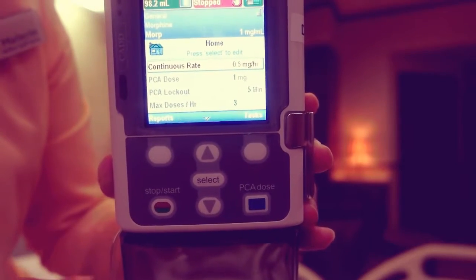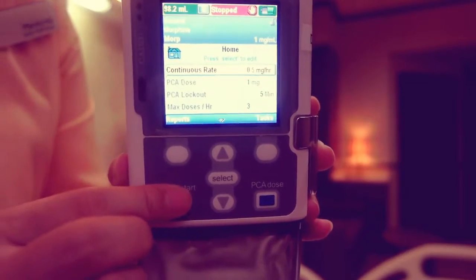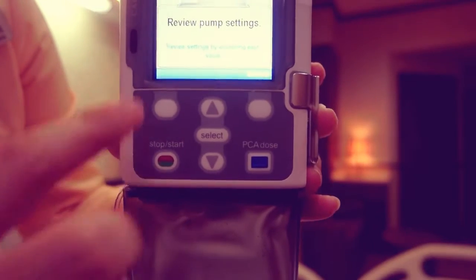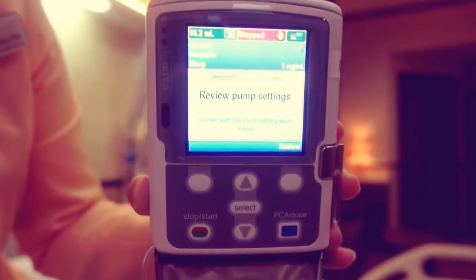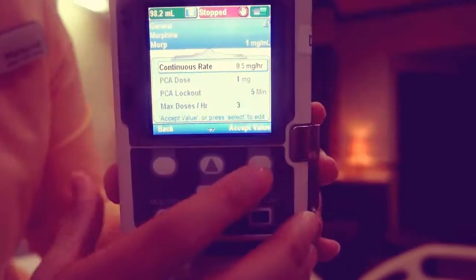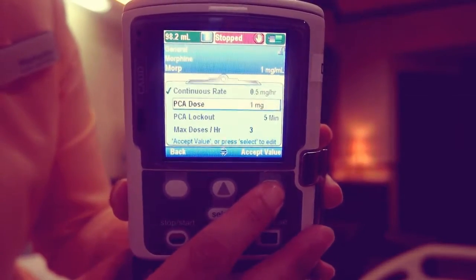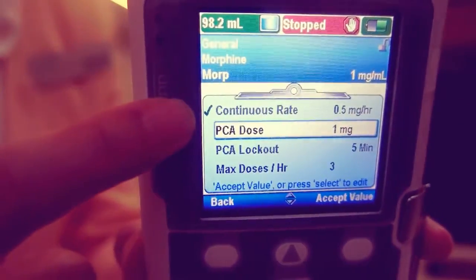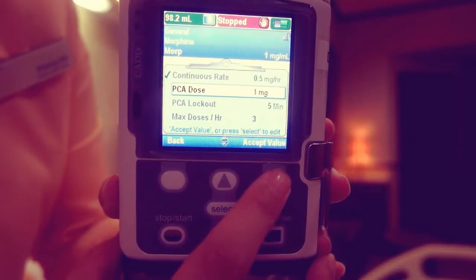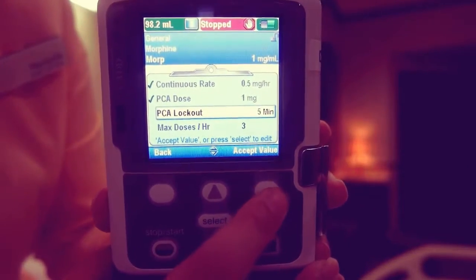When programming is complete, press the stop start button. Review pump settings displays. Press review. Choose accept value to confirm the value is correct for the highlighted patient's specific parameter, or press select to edit the highlighted parameter.